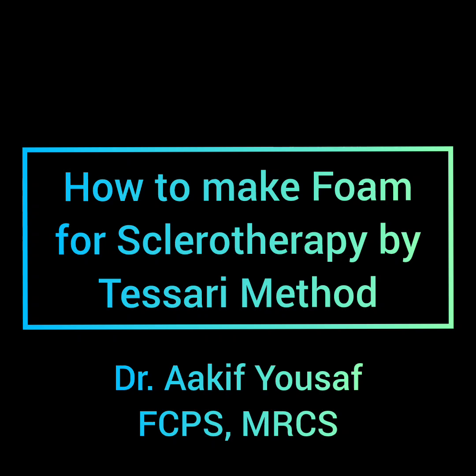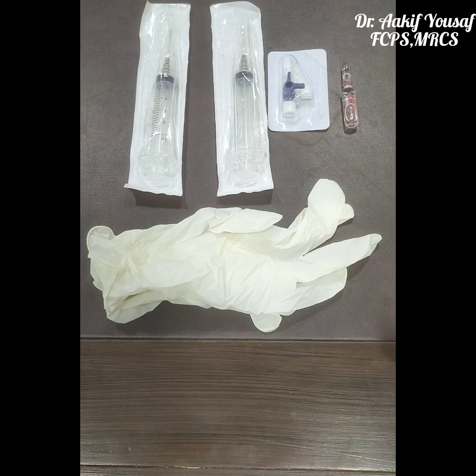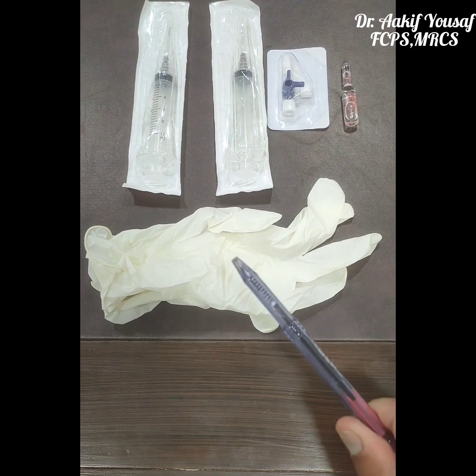Hi, my name is Dr. Akif Yousaf and today I am going to demonstrate to you how to make a foam for the sclerotherapy by the Tessari method. We will use this foam for the sclerotherapy of the varicose veins and the spider veins.